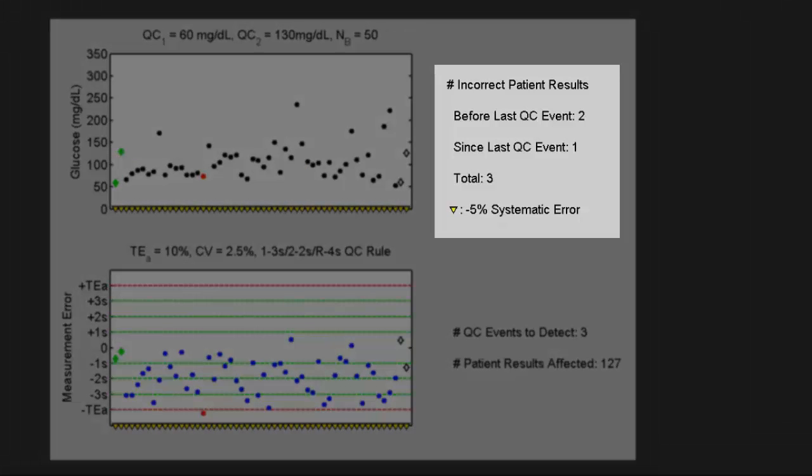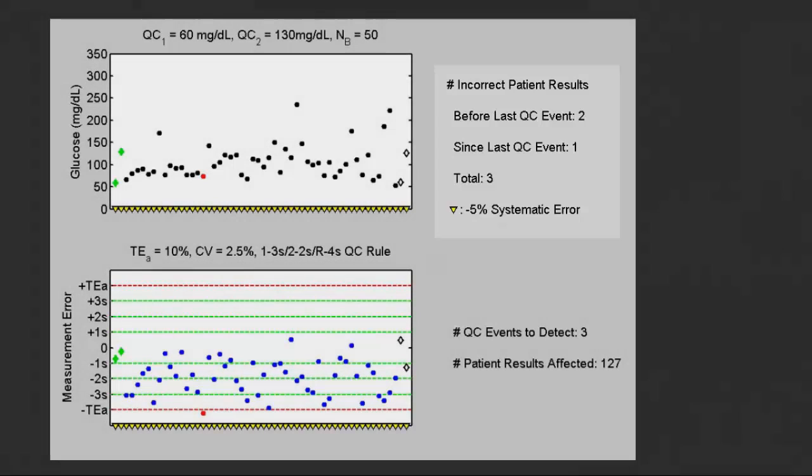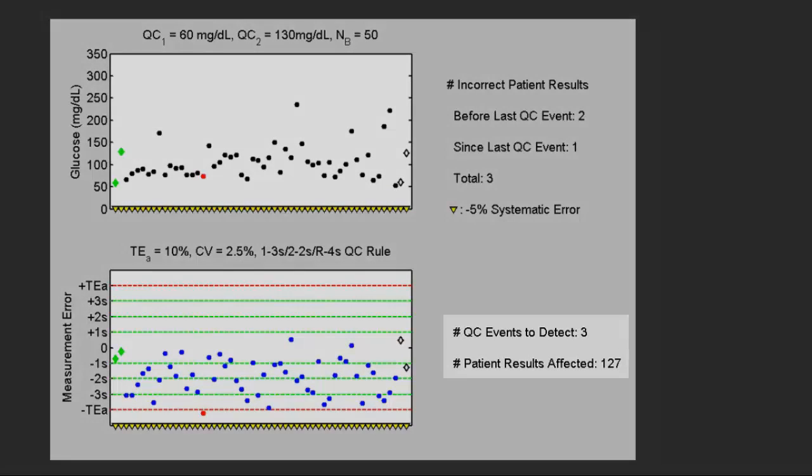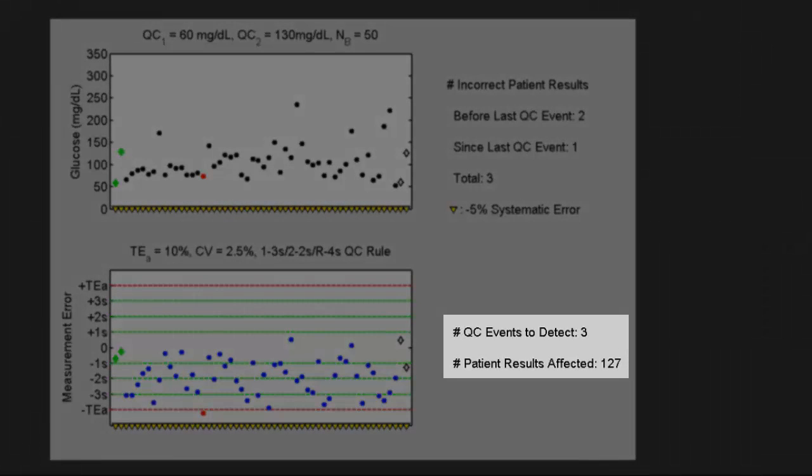Let's continue testing. Here we get another unacceptable result. Notice that we are also keeping count of how many incorrect patient results have been produced. So far we've seen three: two occurred prior to the last acceptable QC and one has occurred since the last accepted QC.